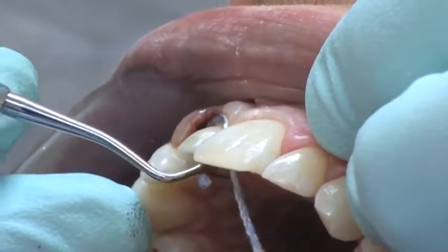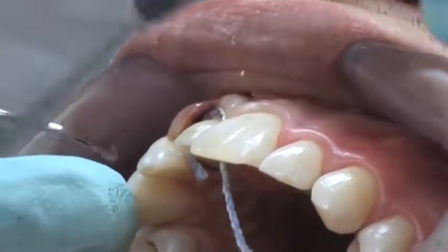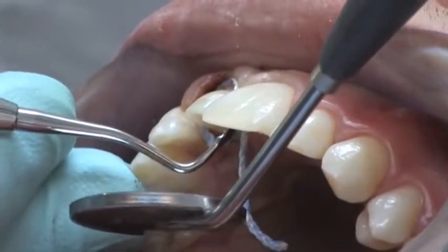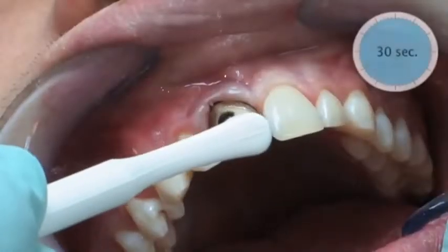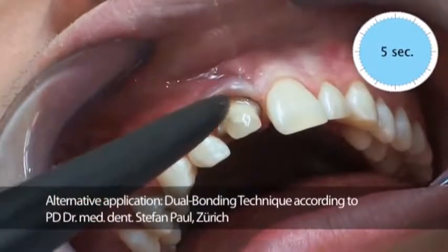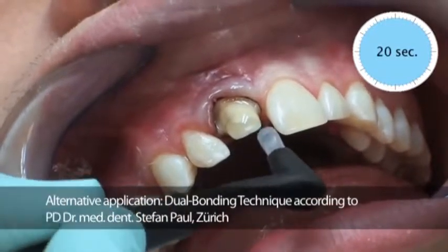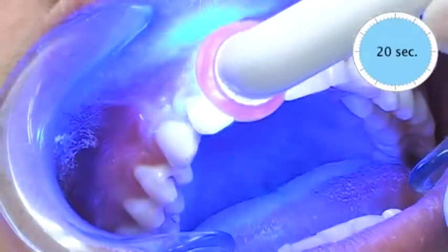Atraumatic compression of the gingival tissue is performed before the final impression is taken using a suitable retraction cord such as ParaCore, with a stable structure and a high absorption capacity. Application of a multi-component bonding system such as ART bond before the final impression seals the dentin tubuli and increases the retention of the restoration. Dr. Paul describes this as the dual bonding technique. The oxygen inhibition layer must be removed afterwards, leaving no residue.